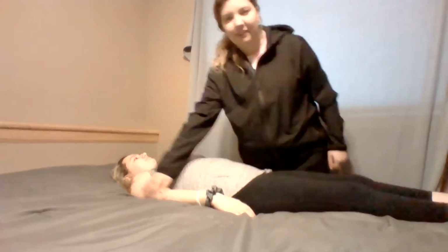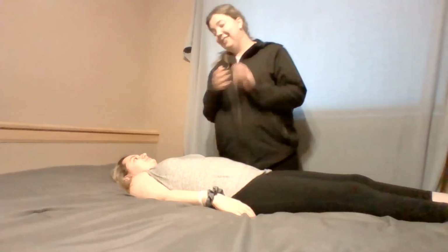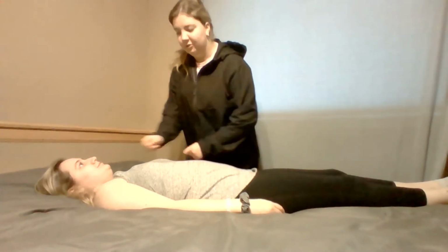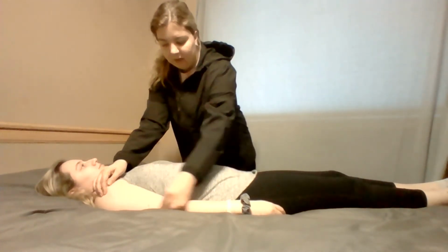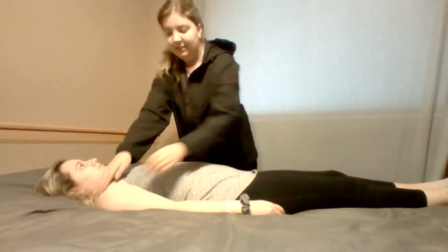First off is shoulder flexion. I will be demonstrating on this arm. You want to find the acromion process, that will be the axis of rotation. The stationary arm is parallel to the thorax, and the mobile arm is the midline of the humerus.